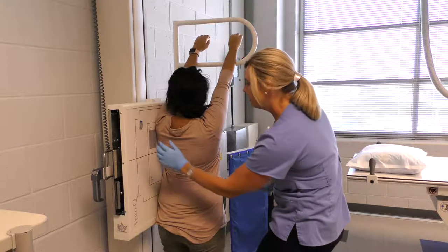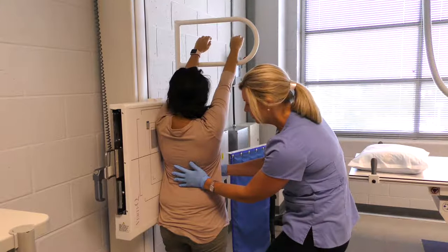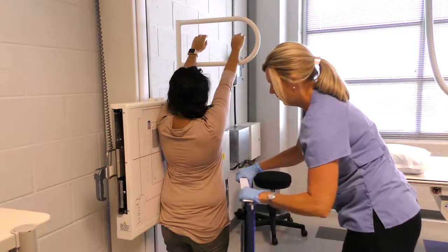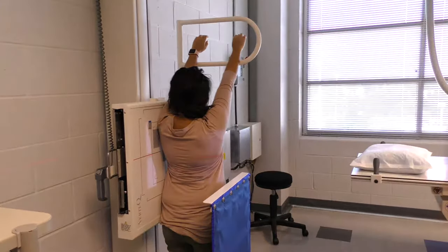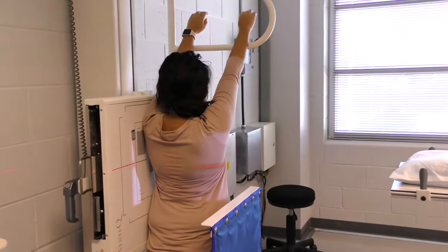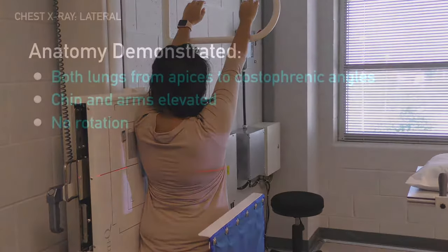Our centering is the same. I'm just going to make sure you're nice and straight. We'll move your shield back. We'll collimate just a little more. Make sure our marker is still in the picture. And our breathing is on our second inspiration.